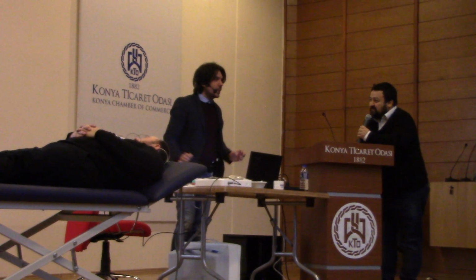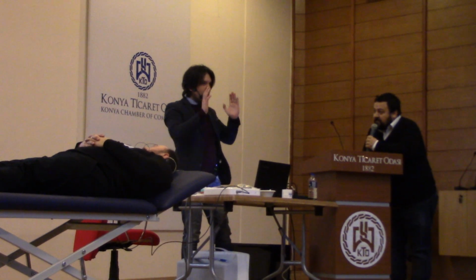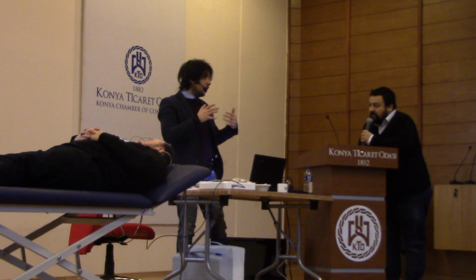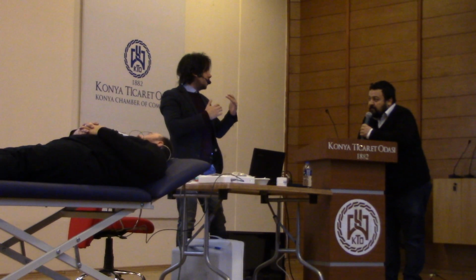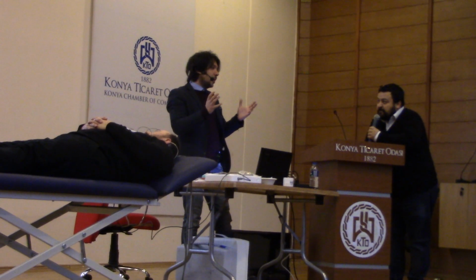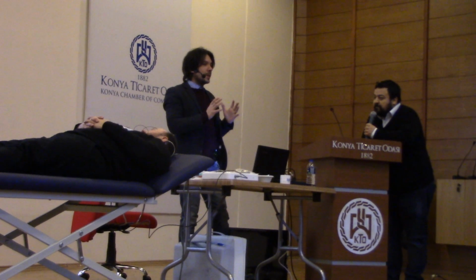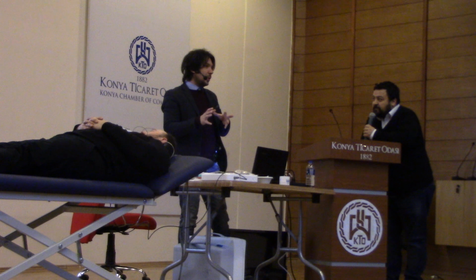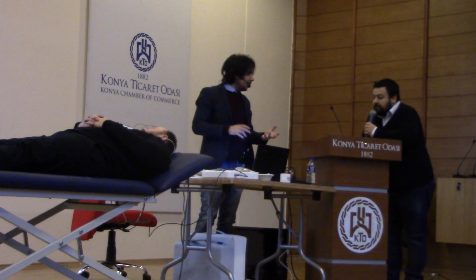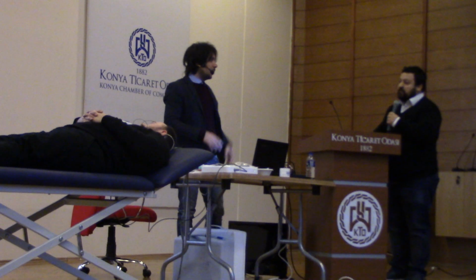What is very important in this kind of test, tone burst ABR, is not so much looking at the latencies too much, but the presence or absence of the complex of peaks. Okay, especially the fifth peak going towards threshold, because it's the method used. If you want to do an autoneurological test, keep on using click. If you want to do a threshold test, an accurate threshold test, use tone burst.